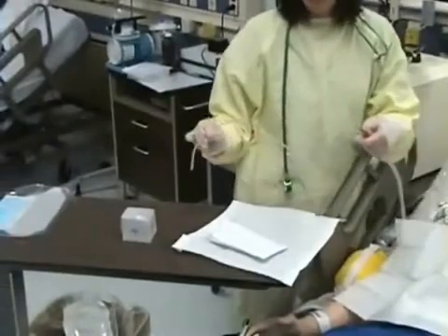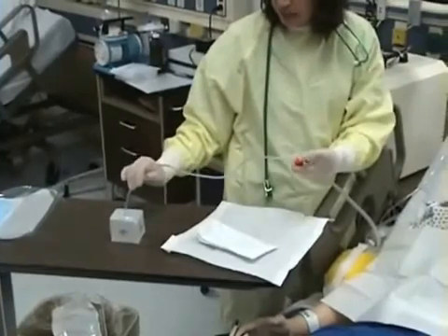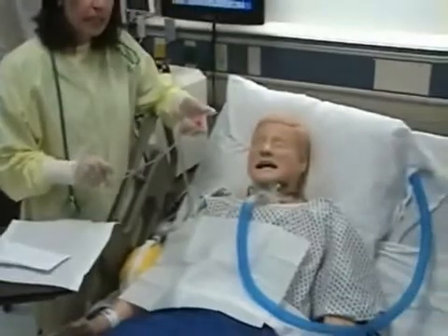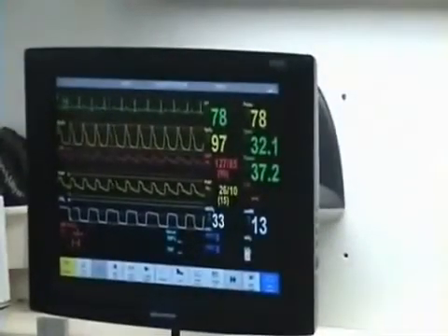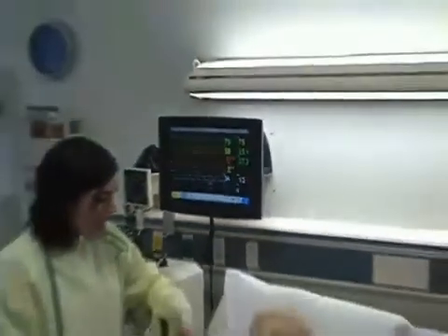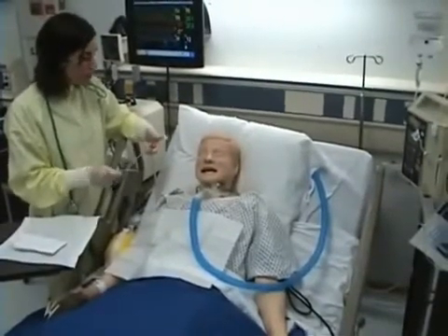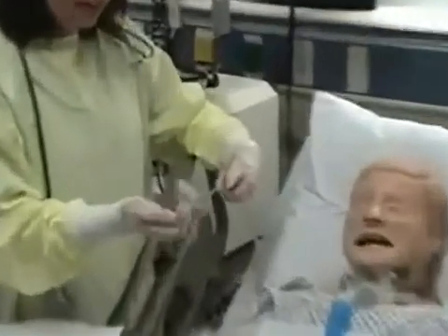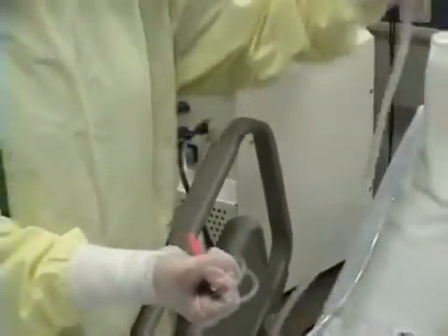I'm now going to take my catheter to my normal saline and apply suction to clear my line. And I may repeat if necessary if my patient continues to cough or I can hear secretions. At this point, my patient sounds clear and is not coughing any longer. So I am going to dispose of my catheter by coiling it in my dominant hand, removing it from the suction tubing.